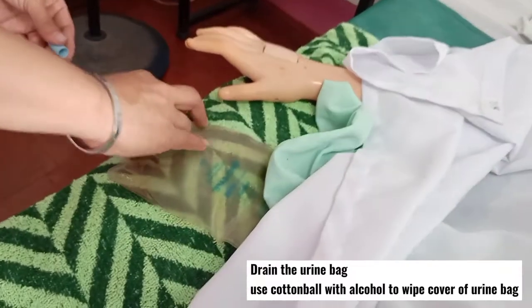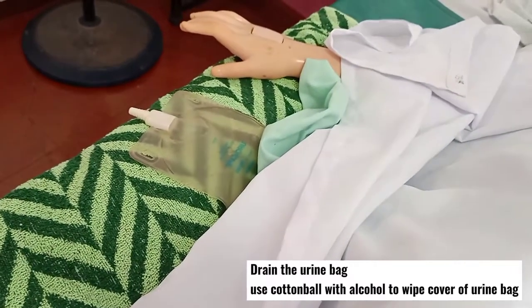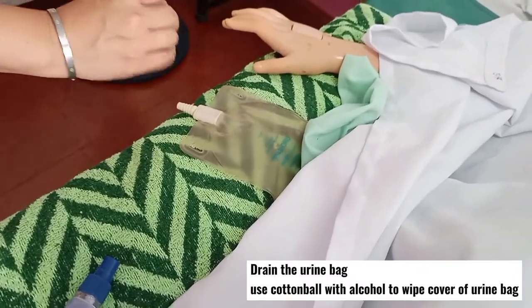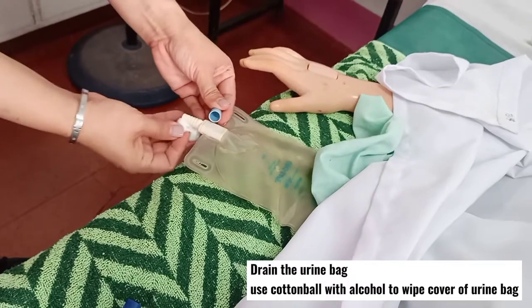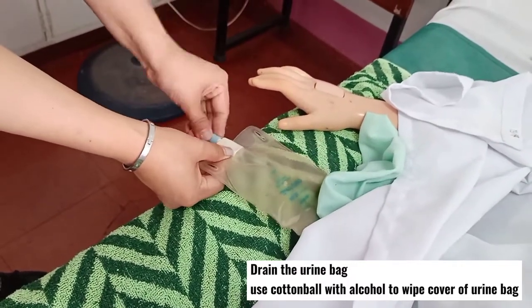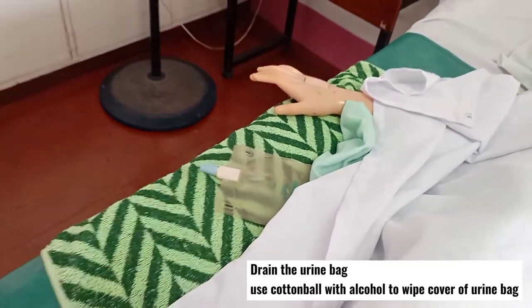Once done, get a cotton ball with alcohol, wipe the lid and the opening to disinfect, then discard the cotton balls.